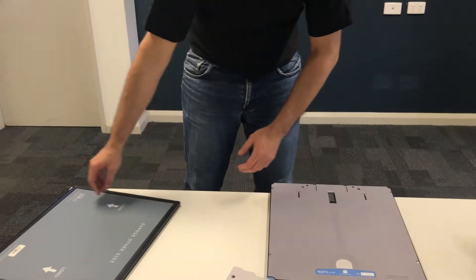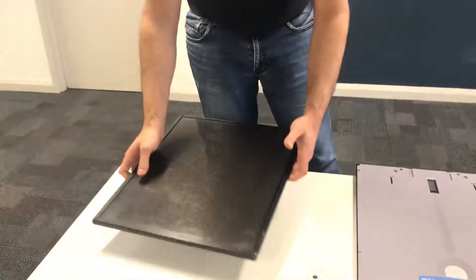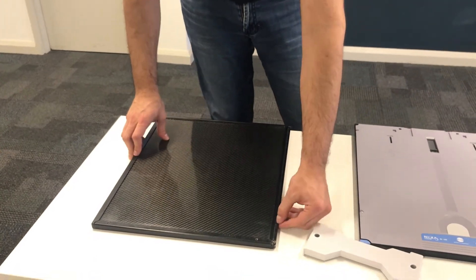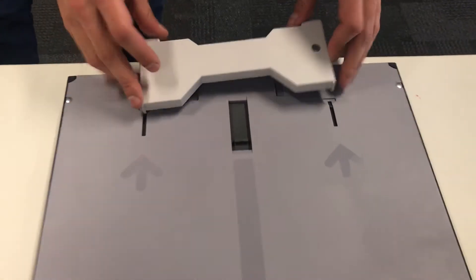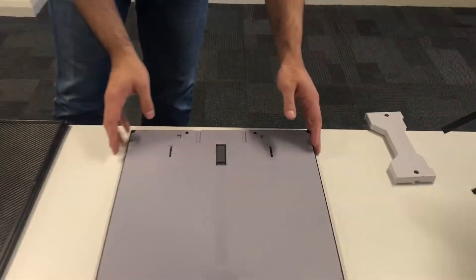Another difference is cleaning. The ICR 3600 is a lot easier to clean — it's just one clip, no special tools required. For the Konica system, you need to use a special tool; otherwise you won't be able to open the cassette.